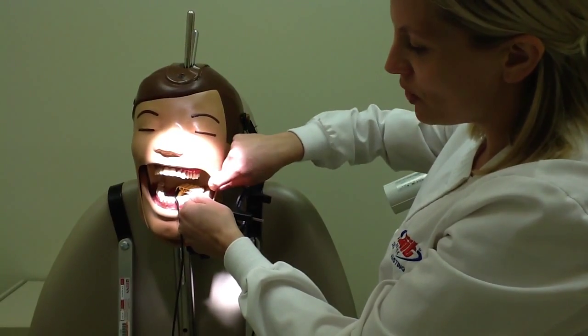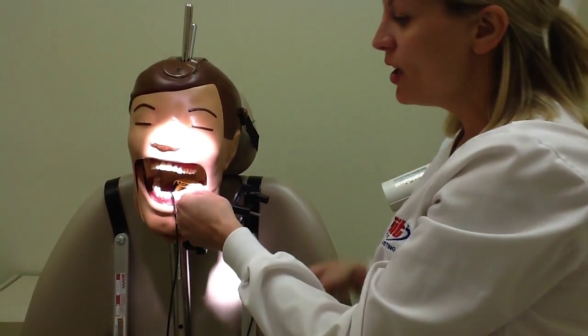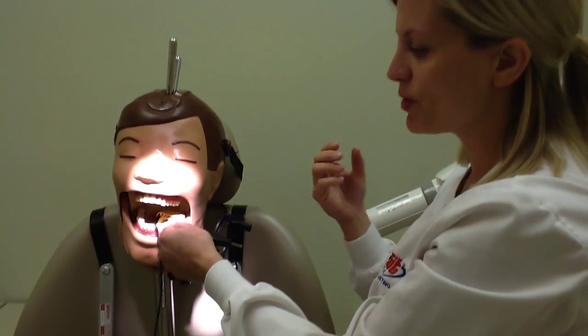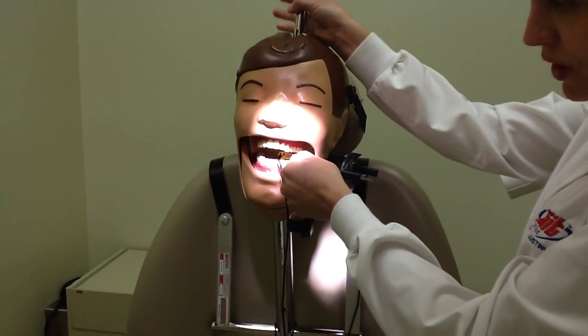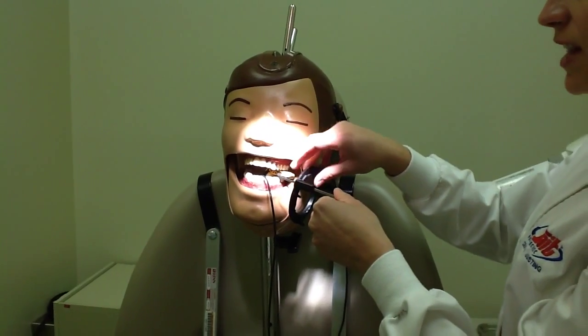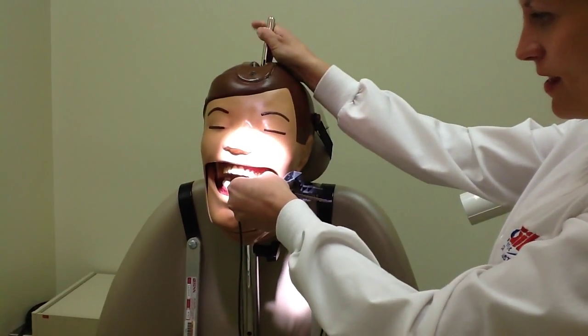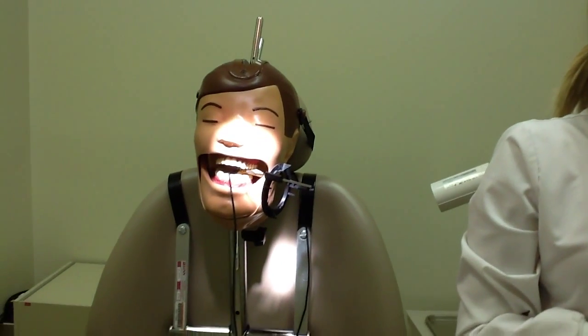Relaxing allows for a lot of space within the cheek and the floor of the mouth, which would be more comfortable. If they're tense and tight, it may be uncomfortable. If they're relaxing as they're closing, it'll become more comfortable for the patient. And just like that, that's the TPR, and that is our paralleling technique.